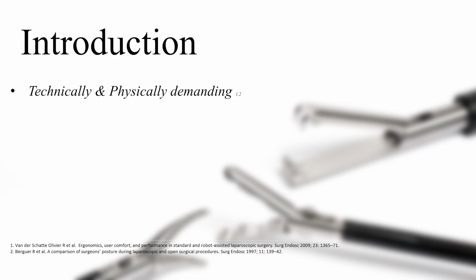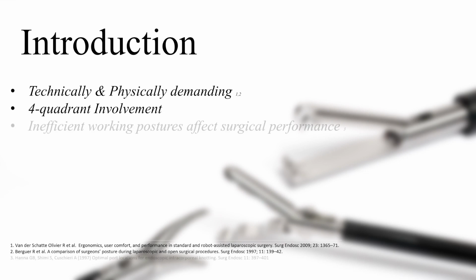Laparoscopic colorectal surgery offers distinct advantages to patients when compared to open surgery. On the other hand, it has proven to be technically and physically demanding. It often requires four-quadrant involvement, has limitations in the manipulation and visualization of tissues, demands long learning curves, and can cause considerable physical discomfort to the surgeon. Inefficient working postures have proven not only to cause that physical discomfort, but also to negatively affect surgical performance.